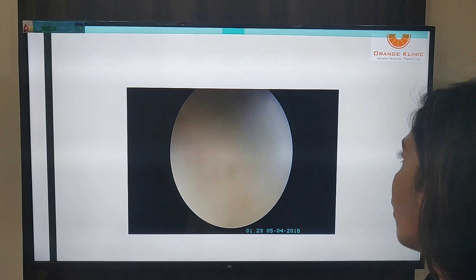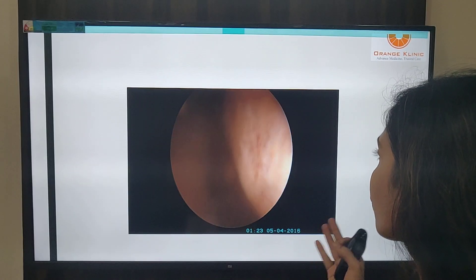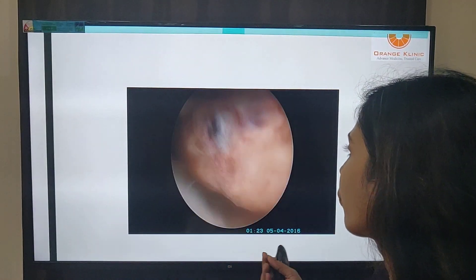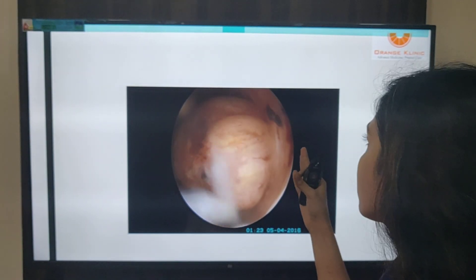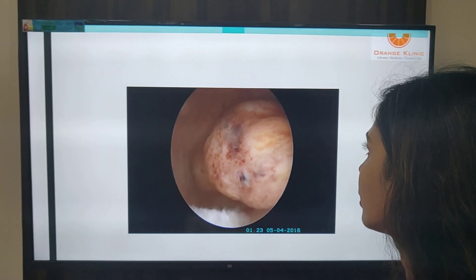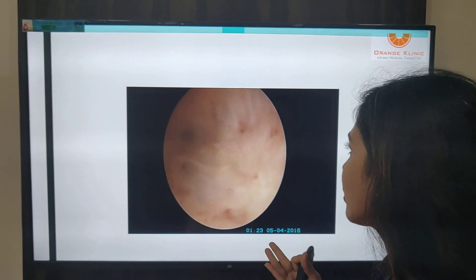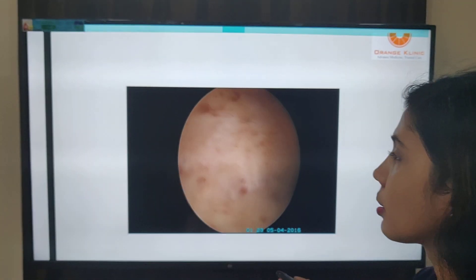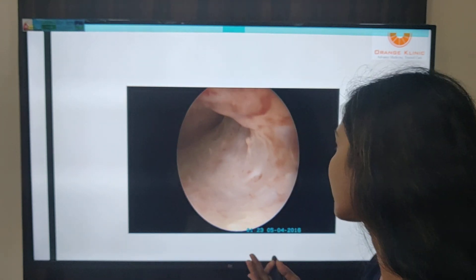Another video shows a case with a lot of blood and mucus inside. We opened the suction to clear it, and we could then see a grade 0 myoma inside the cavity. This patient definitely required further treatment. Nowadays the hysteroscope has become like a stethoscope for the gynecologist — we see and we treat, as we say.